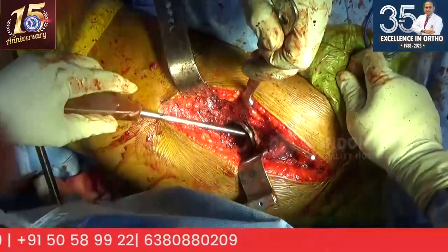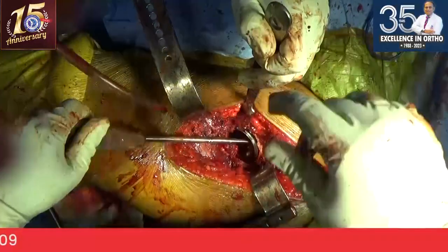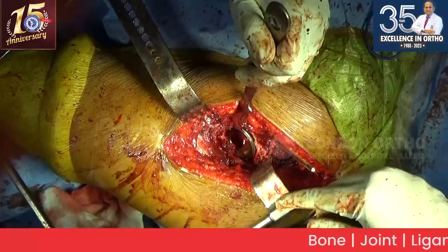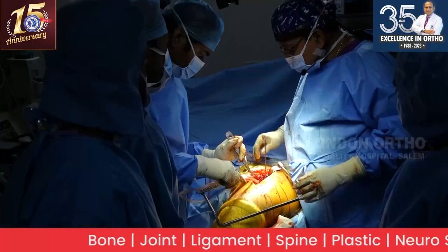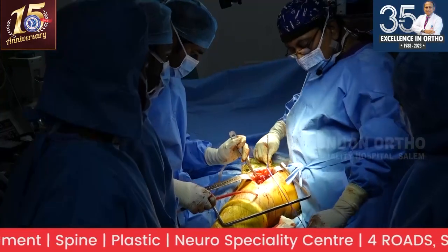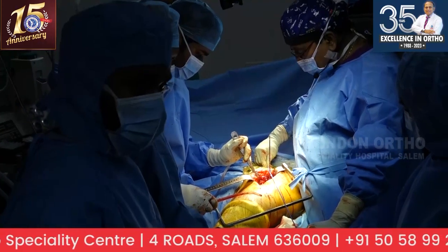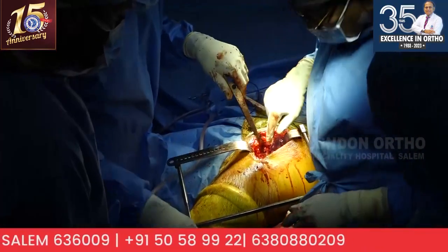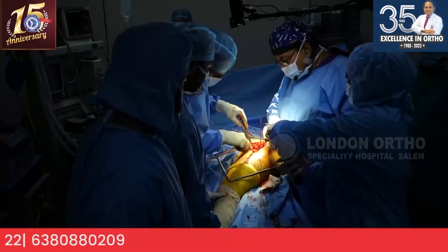What is the final orientation of the cup? It's about 10 degrees anteversion. Inclination, I would think about 40. On the camera, it looks somewhat more retroverted. Maybe the camera position. No, sir, it is always like that. This is the center. I am holding the opposite leg, which is straight. It will usually look like that. So here we cannot say at all. Only the surgeon's eye view.